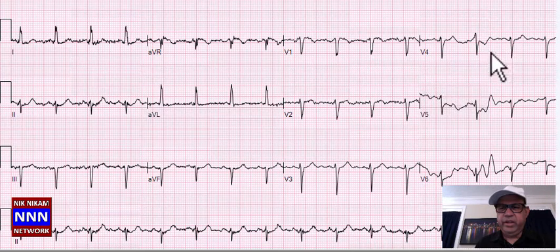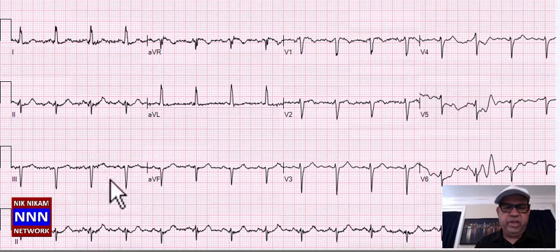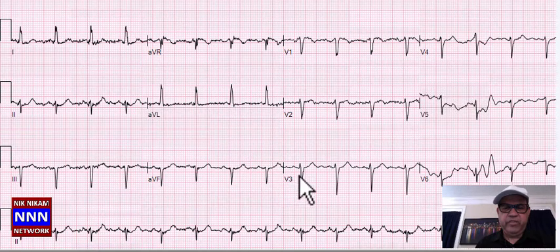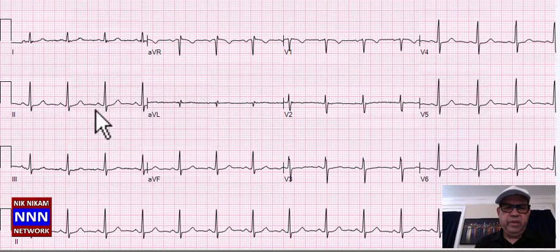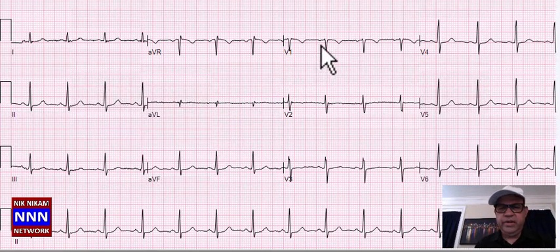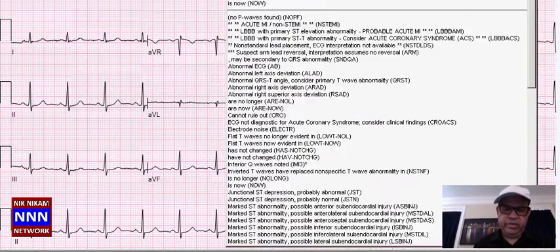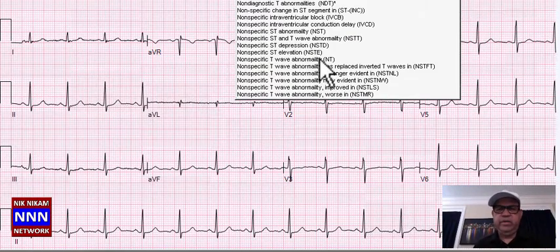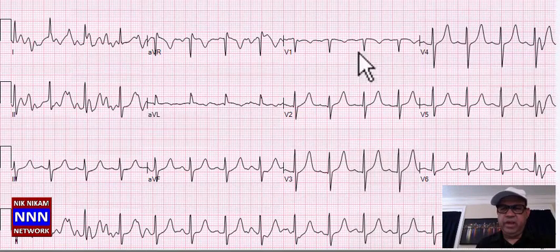Another sinus rhythm with baseline artifacts, loss of R-waves anteriorly and laterally, left axis deviation, left anterior hemiblock, with non-specific ST-T changes. Next: sinus rhythm, inferior leads okay, anterior leads with slight flat T-wave changes — non-specific T-wave changes, nothing really spectacular. Baseline artifacts, sinus rhythm, no significant changes.